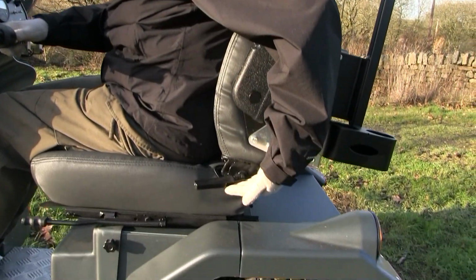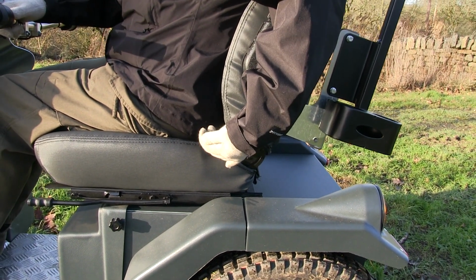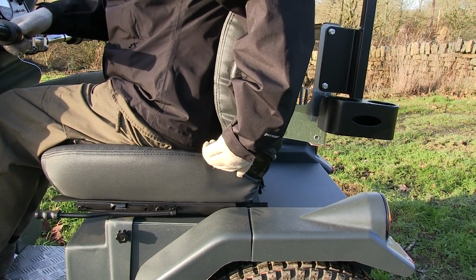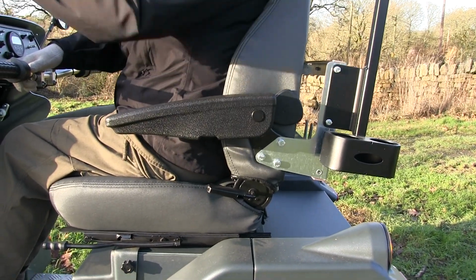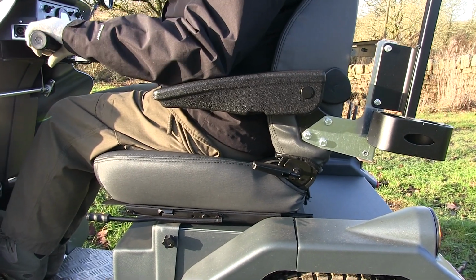So the next thing to think about is the position of the backrest. We have an adjustable handle here where if you pull that handle, the seat moves backwards and forwards. Just get yourself in a position where you feel comfortable, and then you can move the armrest so that it's in a position where you can rest your arm comfortably on there and have your hand on the twist grip.